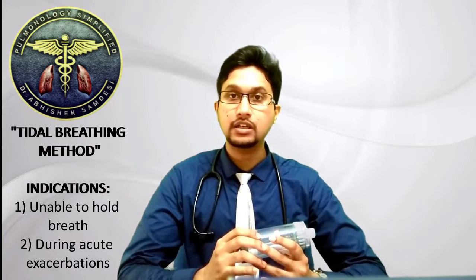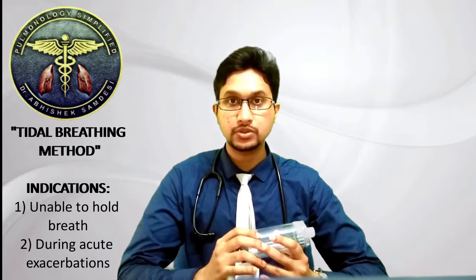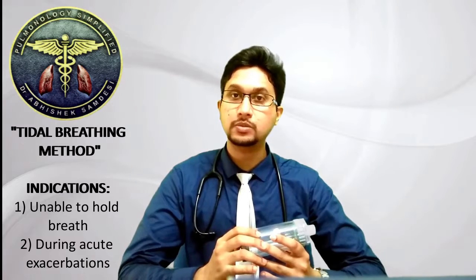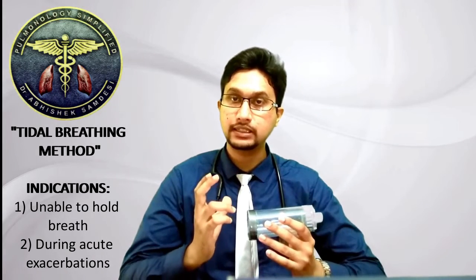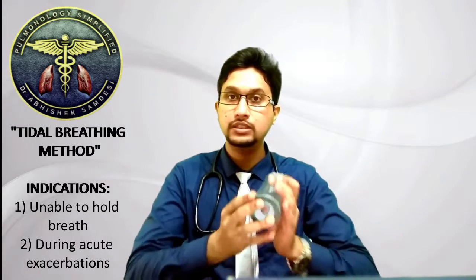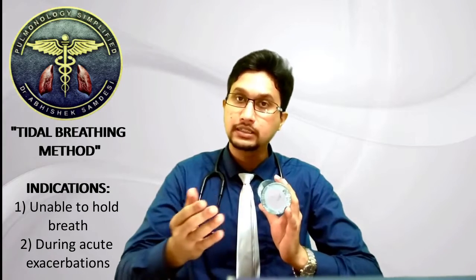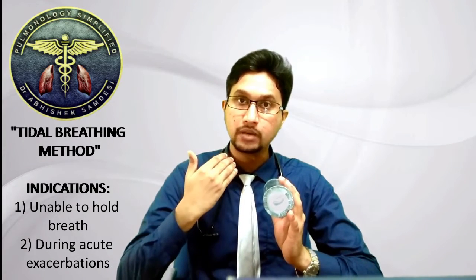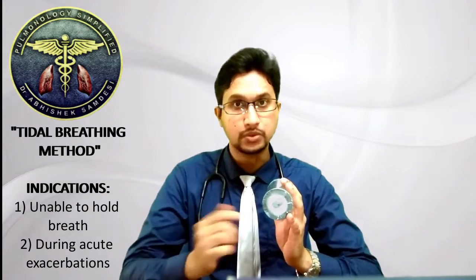For patients who are unable to hold the breath for a long duration, there is another alternative which is the tidal breath method. After pressing the inhaler, they are supposed to hold the spacer in their mouth and inhale via the mouth and exhale via the nose.